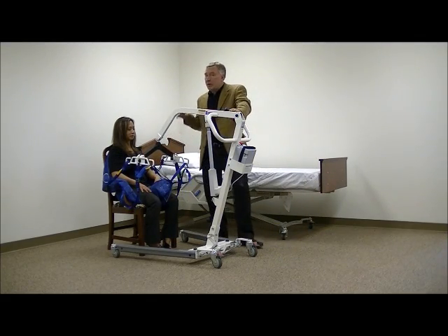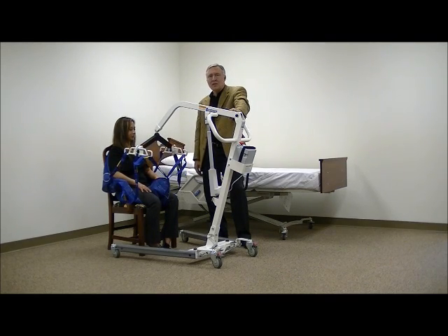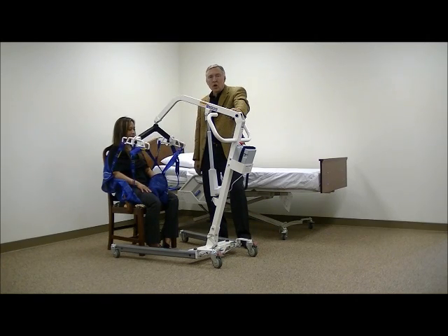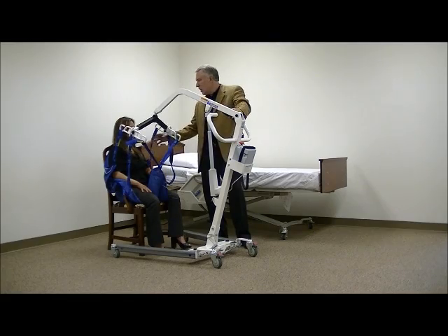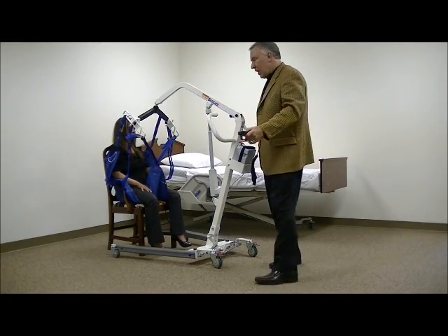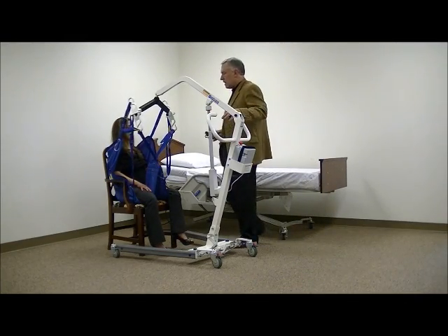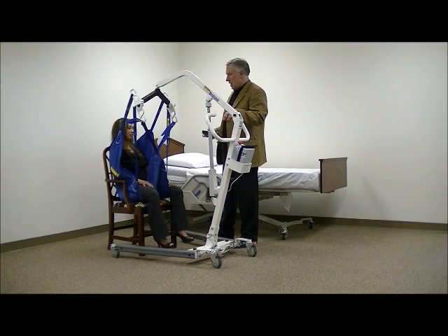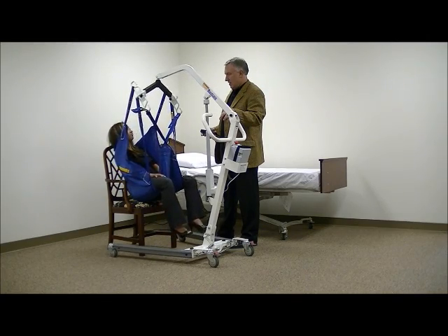You always want to pay extremely close attention to the loops. You want to make sure there's no chance of disconnecting the loops from the spreader bar. That's the most common reason for somebody getting hurt, is somebody not paying attention to the loops and one of them not being hooked up right. So we can see here that we got all the loops hooked up. We're hitting the up button here. You can see that the motor on the lift is raising that boom up. You okay? And then up we go.